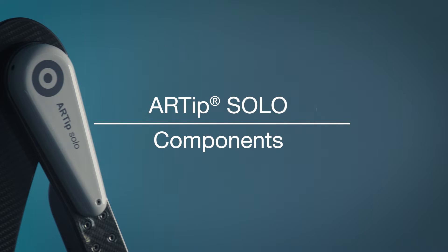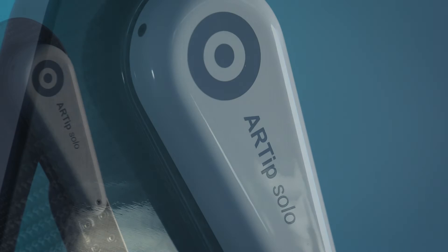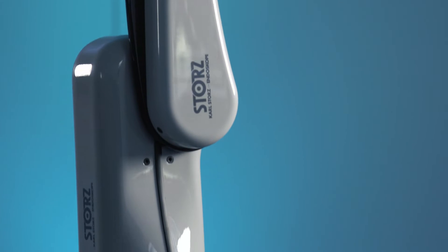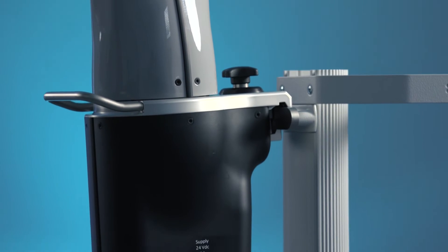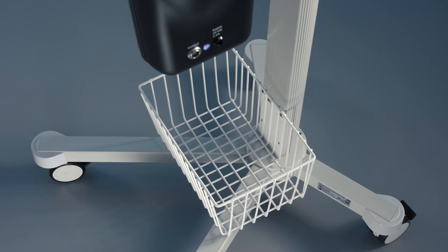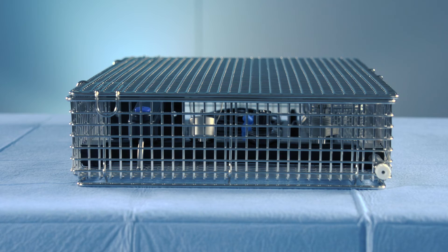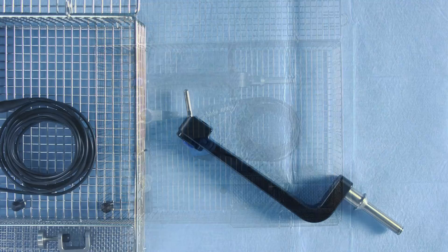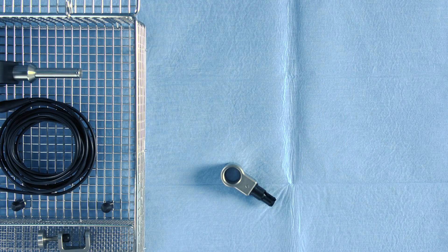The Artip Solo consists of the following components: the robotic arm with a trolley that is used for transportation and storage, and a sterilization tray that contains a universal joint and a scope clamp.